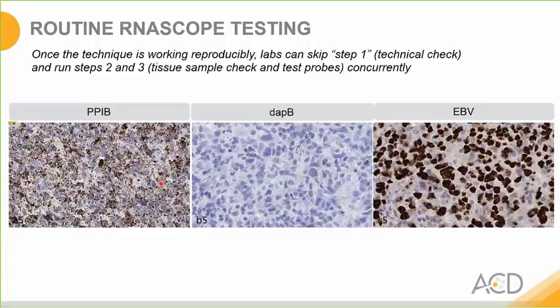In this RNAscope experiment shown for assessment of EBV in a target tissue of interest, this strategy was done where, since the assay was working in the lab, we proceeded immediately to testing the target tissue with positive control probe, the negative control probe, as well as the target probe, which is EBV in this case, all concurrently in order to save time. And this is really the most efficient way to use the assay once it's up and running in the lab. In this experiment, you can see that obviously the RNA is intact, as indicated by the strong staining with the housekeeping positive control probe, PPIB.